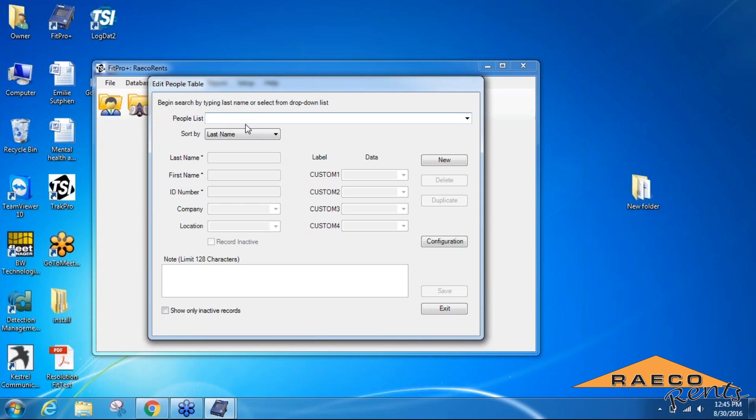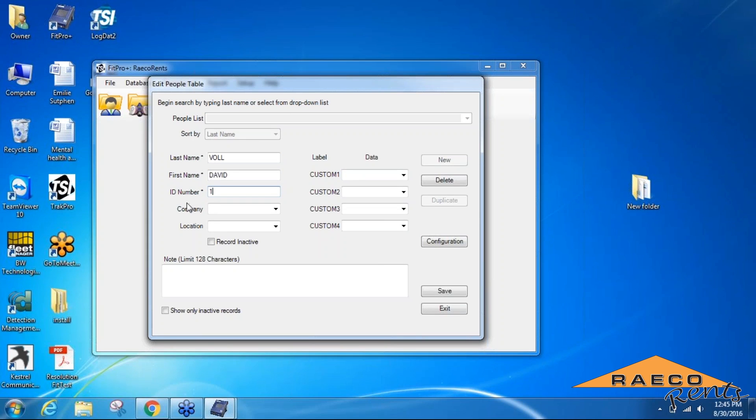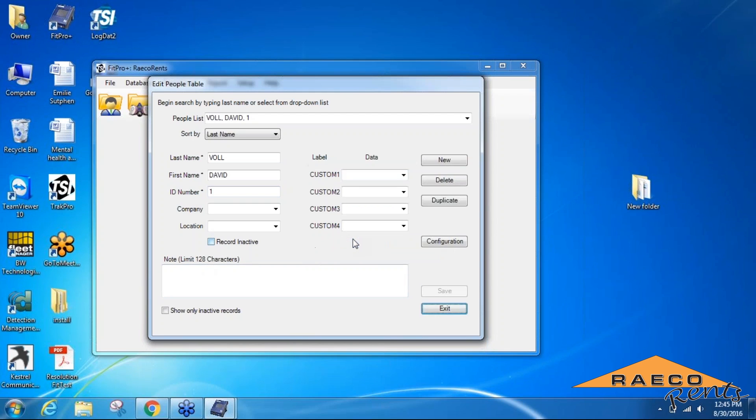You'll start that by clicking the new button, and we'll add in the last name, first name. You pretty much have to fill in any of the fields with an asterisk next to it. Even if you don't have an ID number that you use, you can just give yourself a number and then save that.